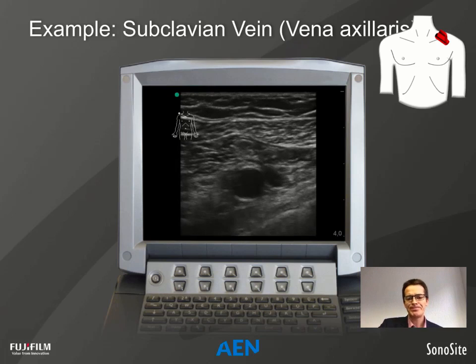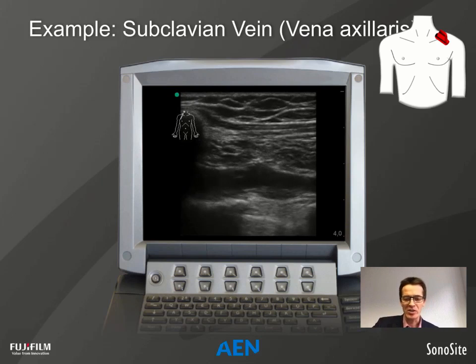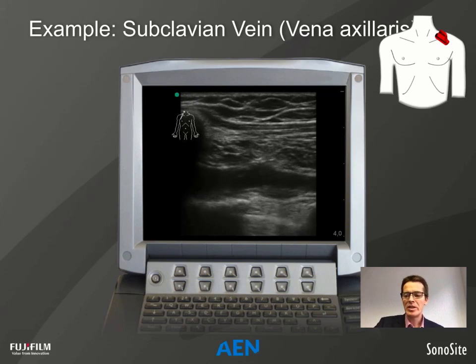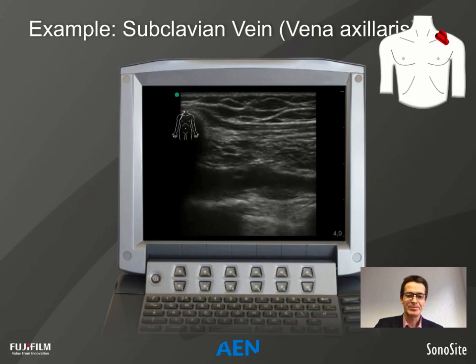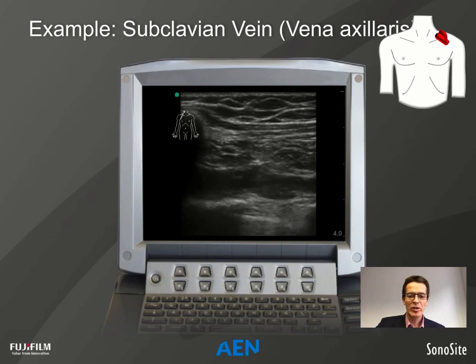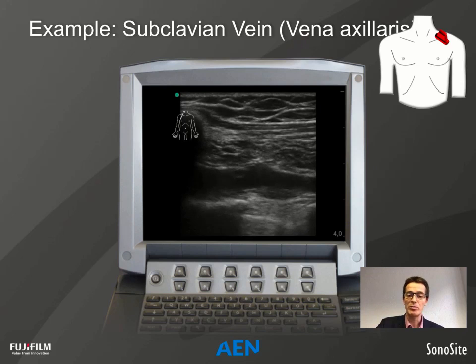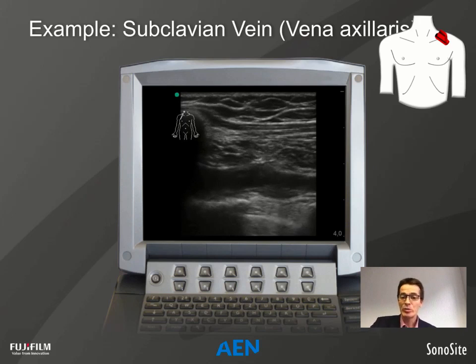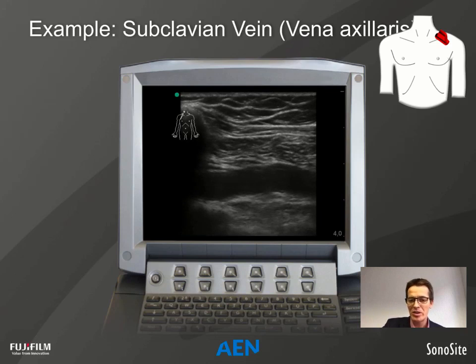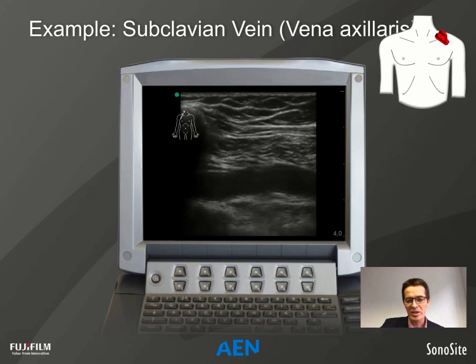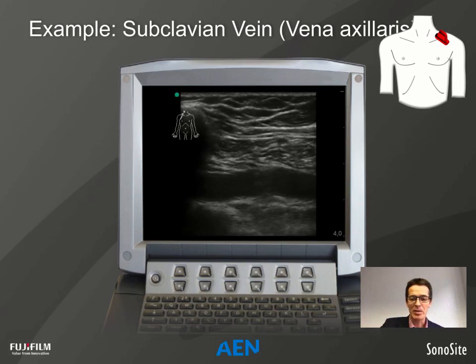We use this short-axis view only as general anatomical orientation. For the puncture we rotate the probe to long axis, deliberately placing the clavicle on the image just under the body marker, giving us the subclavian vein in long axis. Under the vein we have the first rib, then pleura and the second rib. Since we know the artery is lateral to the vein, we check it to be certain and safe for the patient. In poor scanning conditions we may use pulse wave Doppler, then go back to the vein.